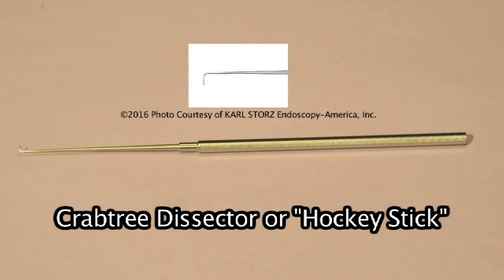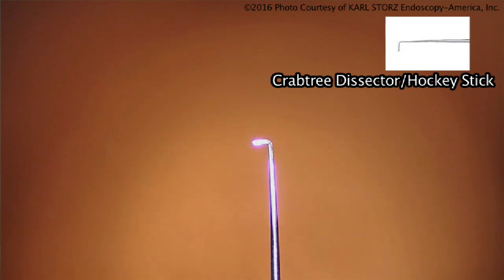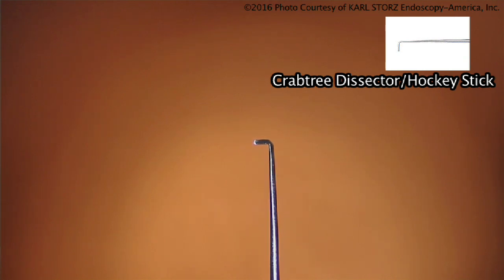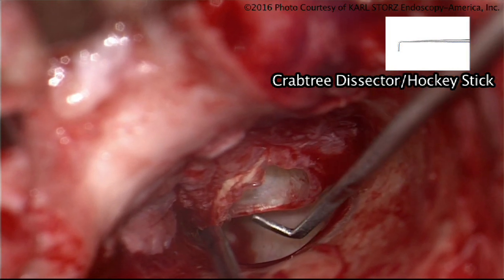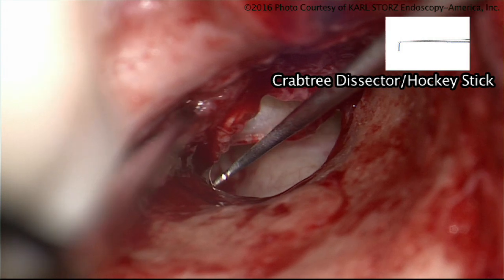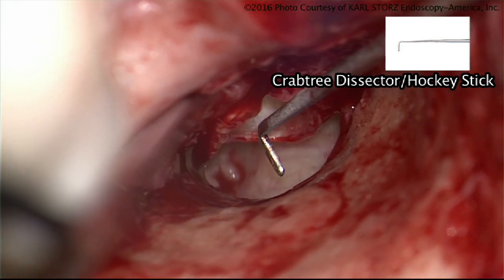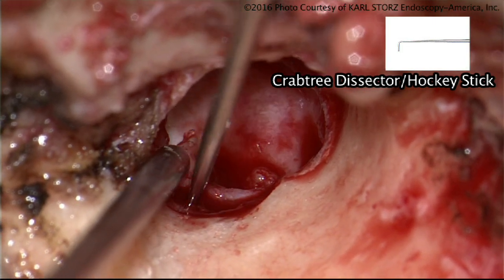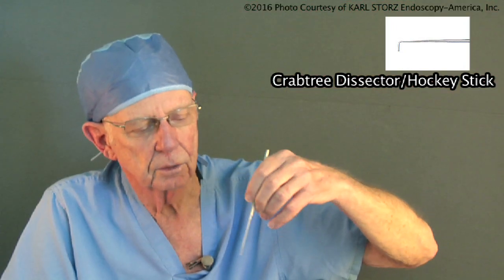Once I'm inside the ear, oftentimes I'll move to the hockey stick or Crabtree. Dr. James Crabtree was a physician at the Otologic Medical Group who taught me during my training. Through his work, he developed an instrument that allowed separation of soft tissue away from overhanging areas, especially when dealing with the scutum where you couldn't really see back into the mastoid. There became both a small and large Crabtree dissector, designed to get around corners — for example, to shell out cholesteatoma underneath the annulus.